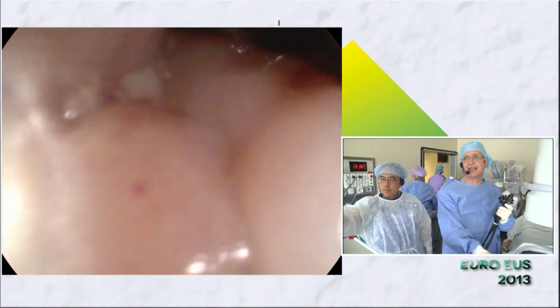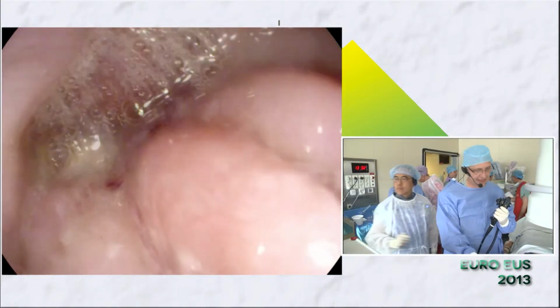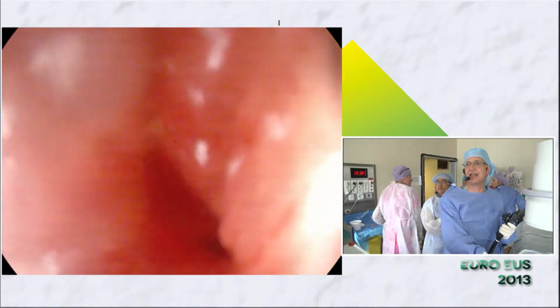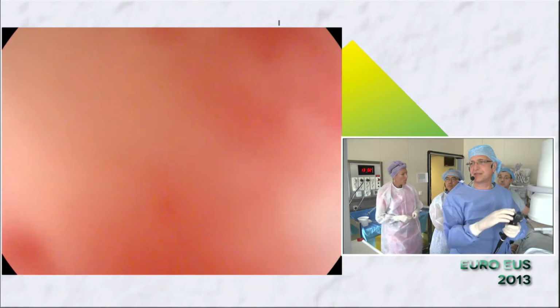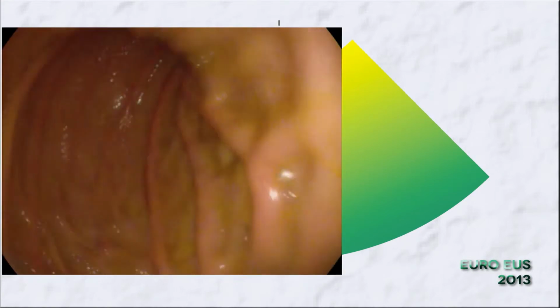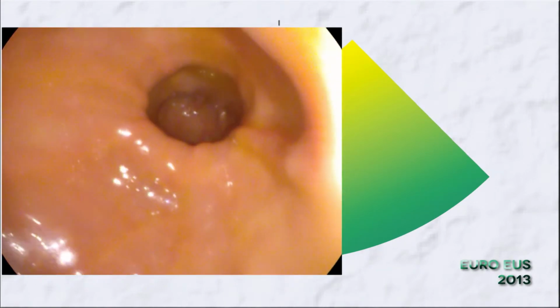The scope we have is a Pentax 3.2, the standard gastroscope. We are here at 30 centimeters from the teeth. Very gently I try to see if I can pass through. When you push like that, always be sure that you see something in front of you, because otherwise you can really make problems. And if you are not sure that you can pass a stenosis, just make an injection with some contrast. I think that this is always the best solution.